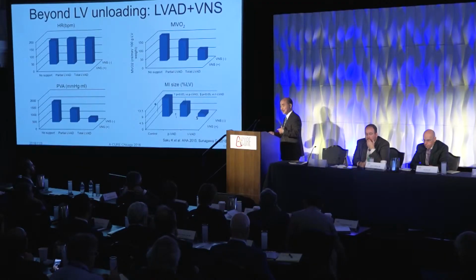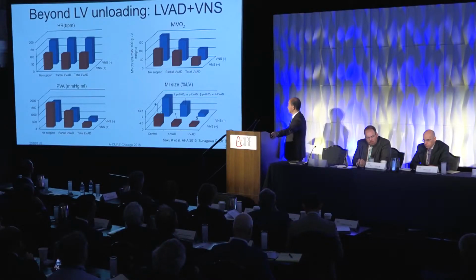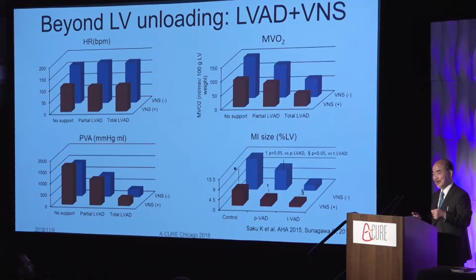The data I'm going to show you is not generated by the smart Impella system, but I think the idea is the same. If you look at only this part, it is very clear that for any given ventricular assist support level, whether the vagal nerve stimulation is plus or minus, the heart rate is different. So the lower the heart rate, the infarction size is much smaller a month later. So we can control the vagal system by electrode. We are now developing a very simple electrode that may be applicable in clinical settings. So if we combine that, we can feedback control vagal nerve activation, and therefore heart rate. Then we combine that with smart Impella, we can achieve this in patients.